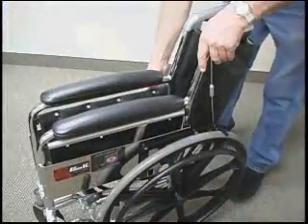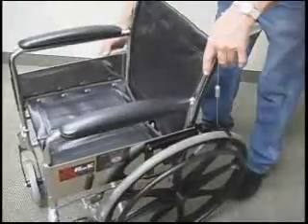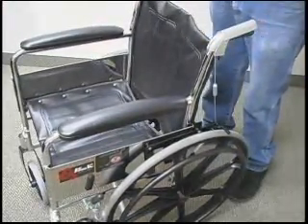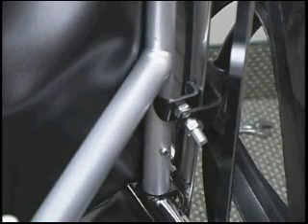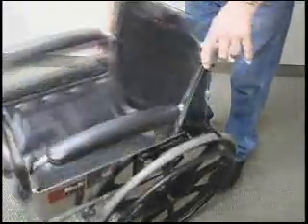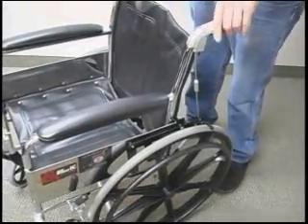When unfolding the wheelchair, please keep the chair level for best stability and to ensure that any actuating levers will remain in their optimum alignment. Proper alignment for the saddles on the actuating arm is behind the cross brace on both sides. Opening the wheelchair on level will ensure that the saddles remain in their proper position.